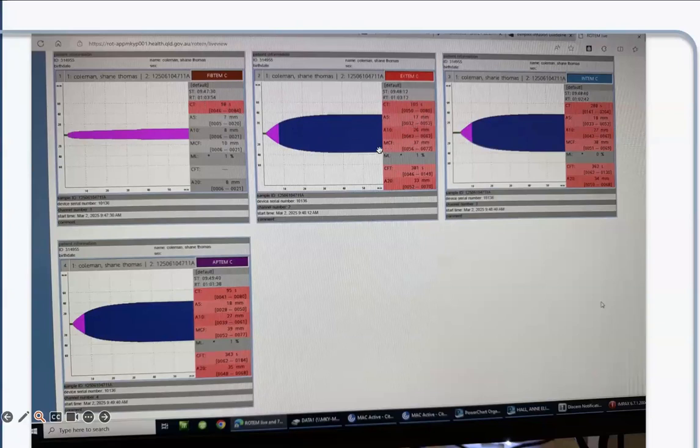So you have that initial thing sorted, right? So the patient needs fibrinogen and platelets. This is the first thing, because if you don't give fibrinogen, the rest of the interpretation is of no point, because the starting point of factor 1 has not been corrected and we are jumping to other factors to see. Once you give fibrinogen and platelets, surprisingly the rest of the clotting will be corrected. So first thing is to do that.